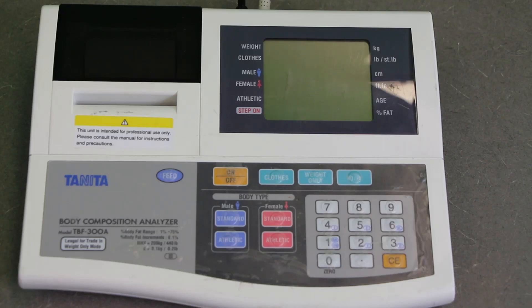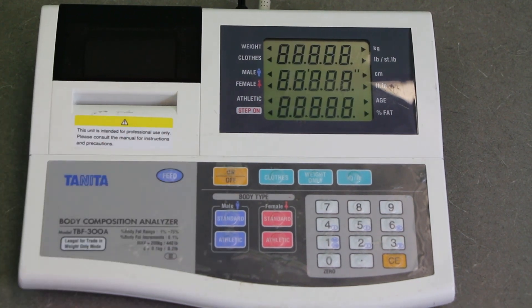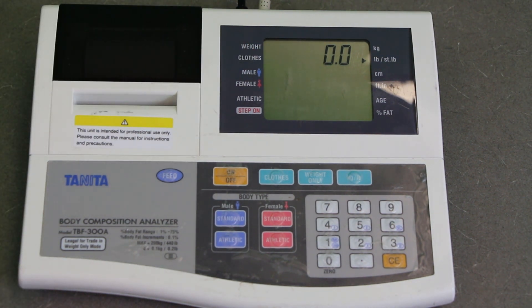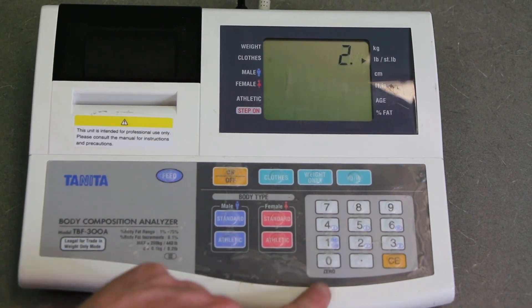Here's the control unit for the Tanita Bioelectrical Impedance Analysis System. First, hit the on button to turn it on. There will always be a flashing arrow telling you what information it's currently asking for. Right now it's asking for clothing weight. If the person is wearing athletic clothing, I usually type in one pound; if wearing more street-type clothing, I type in two pounds. If they're wearing anything heavy or have heavy objects in their pockets, I have them remove those. I'm going to put in 2.0 pounds for this individual.